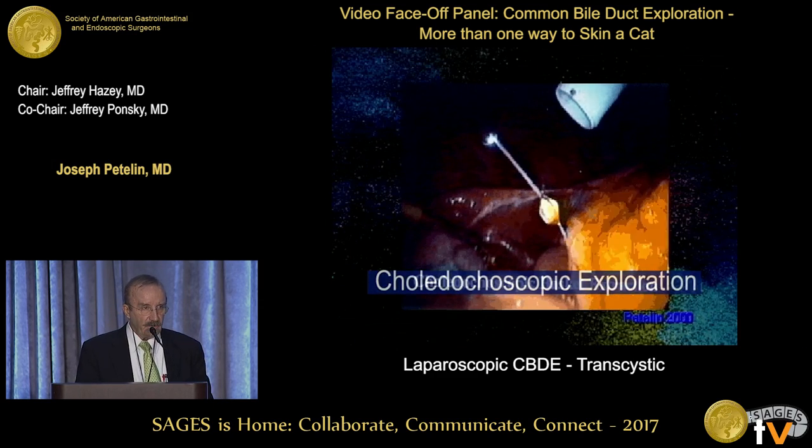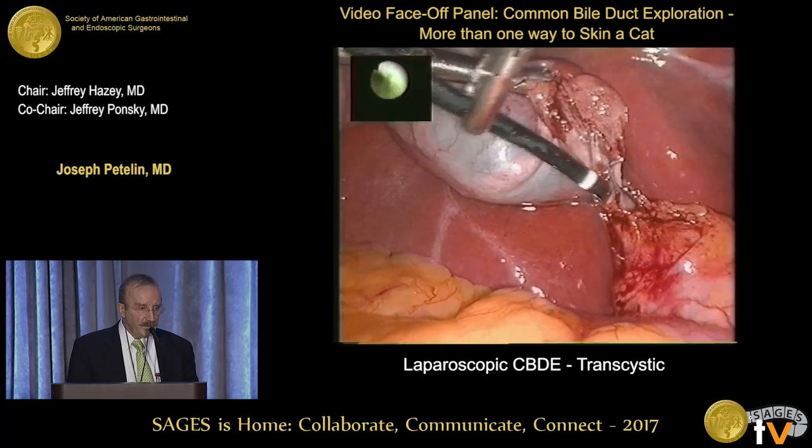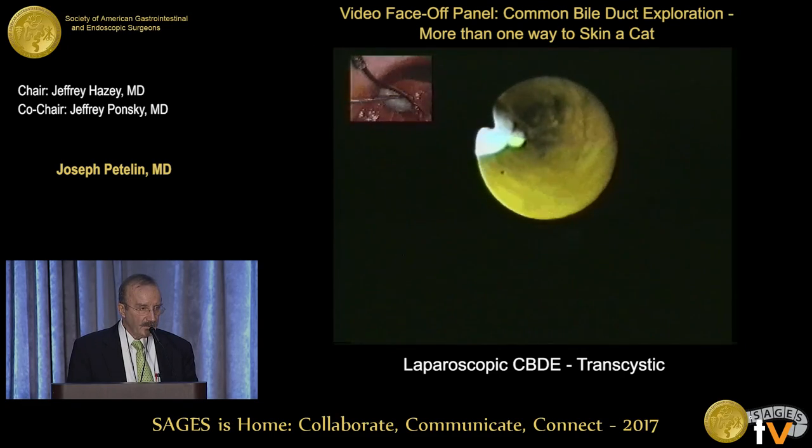And then, if necessary, we can pull out the choledochoscope. That goes in through the cystic duct and into the common. We like to use a four-wire Segura-type basket with straight wires, not the helical ones, and then keep the stone in view with a little bit of the basket available so you can see it come out.